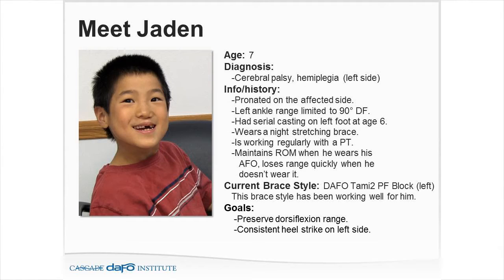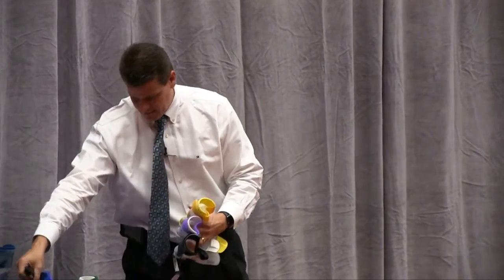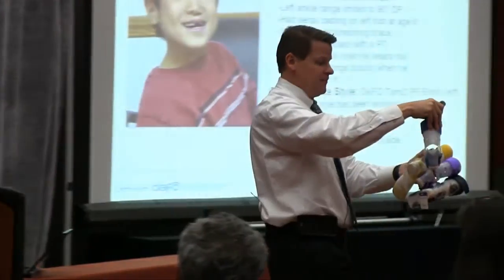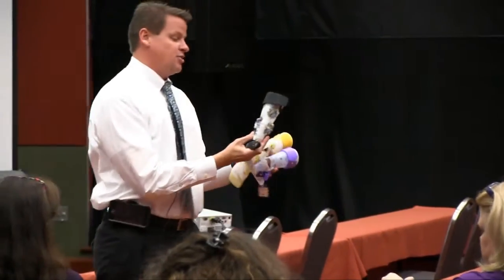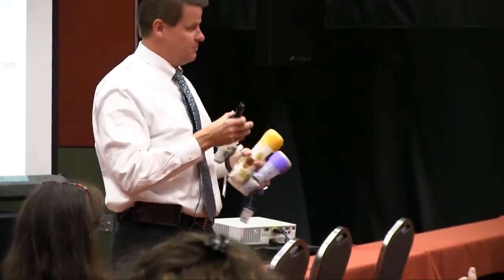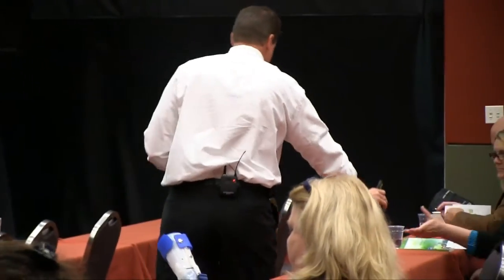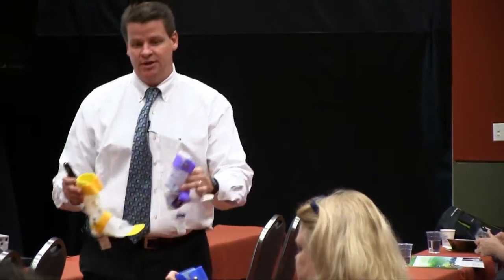Let me send some of these braces around. This is the traditional DAFO 2 — plantar flexion stop, free dorsiflexion. Here's a TAMI 2, which is free motion — TAMI means it has that Tamarack-type joint in it. Here's your free plantar flexion, dorsi assist, and plantar flexion dorsi assist. These are all TAMI 2 models.